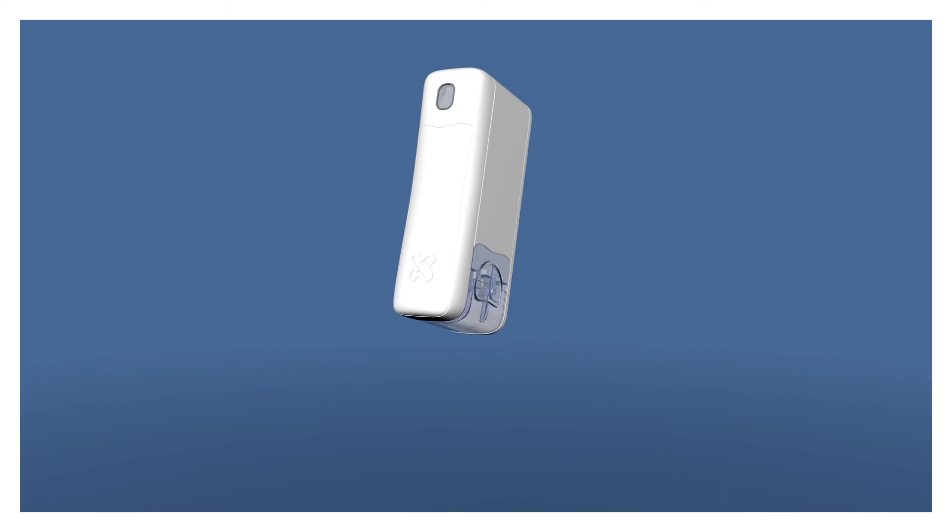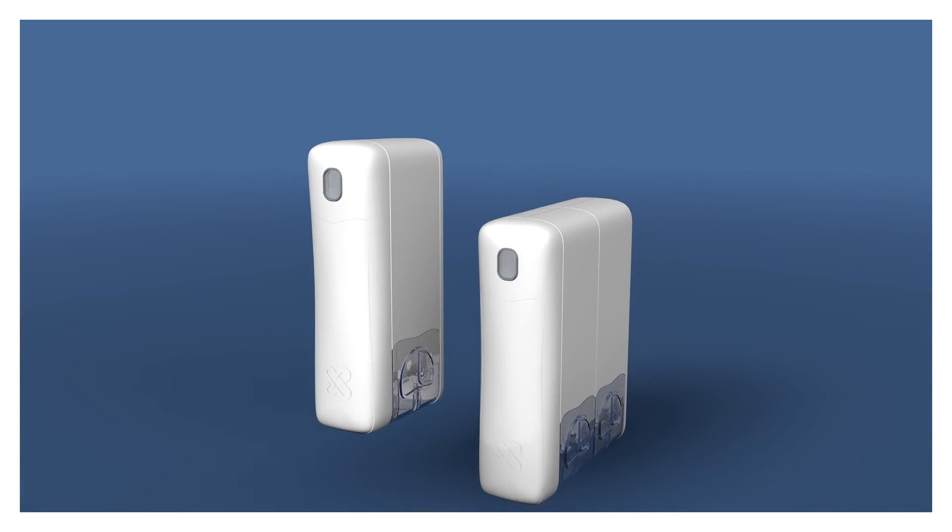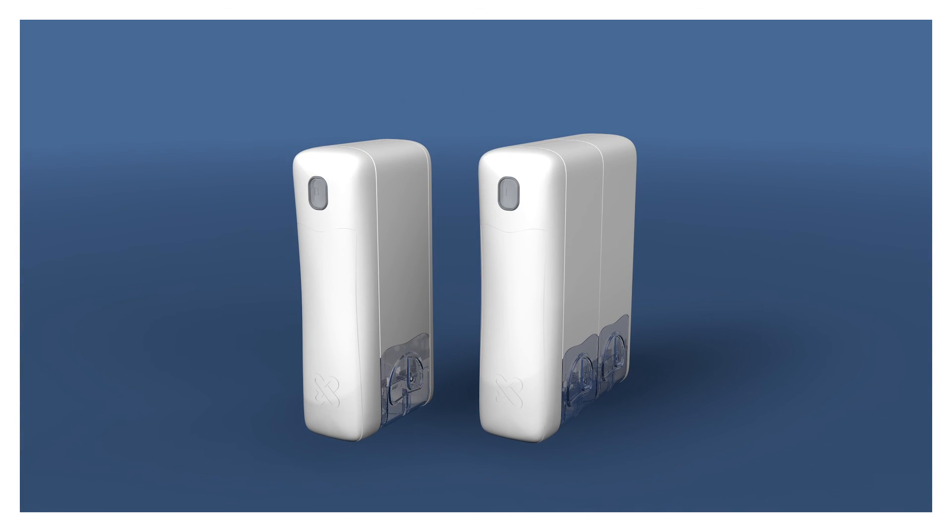There are two models of Medimi, one for two medications and one for four medications.